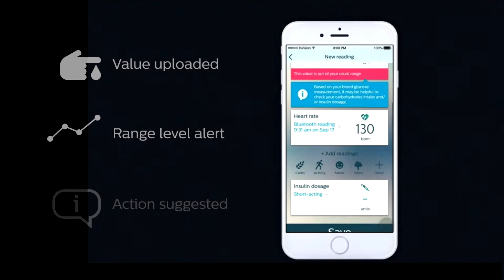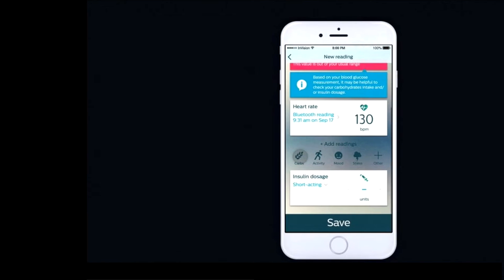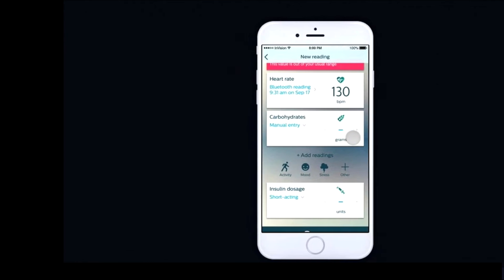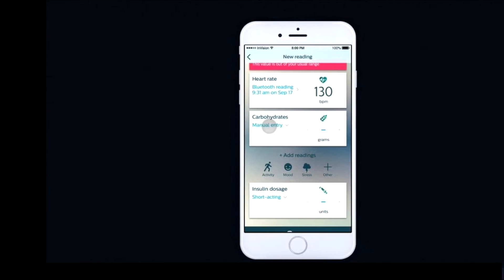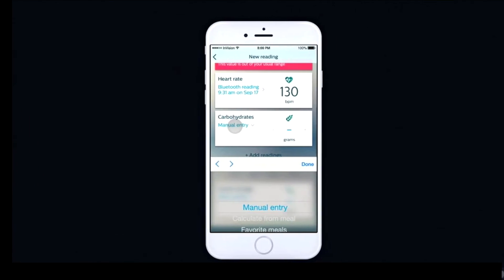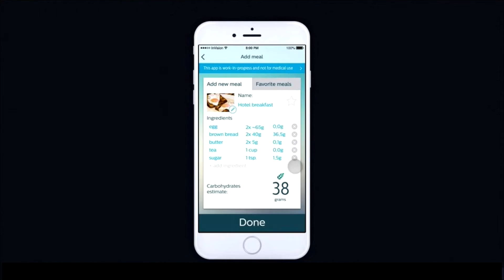At this point, they're able to start entering values that will allow them to make decisions about their insulin dose. For example, they can enter their carbs, and they can do that either by manual entry, by using the carb calculator, or by picking from a favorite meal.